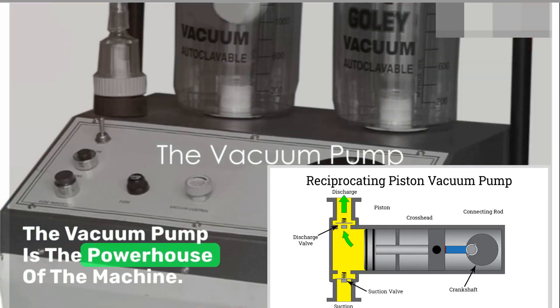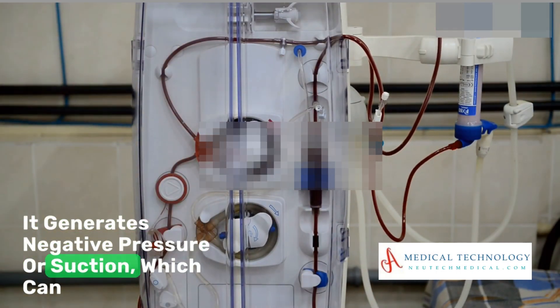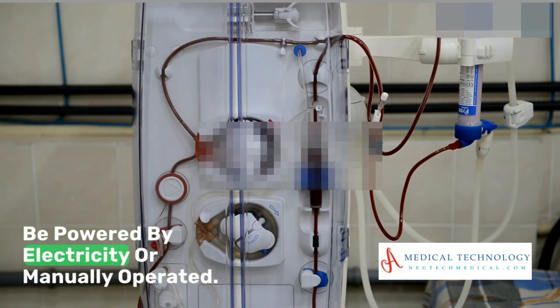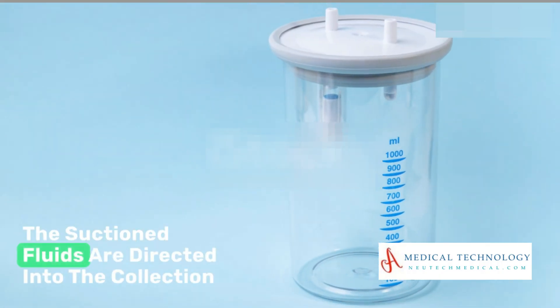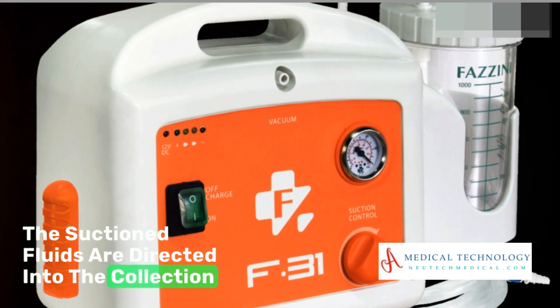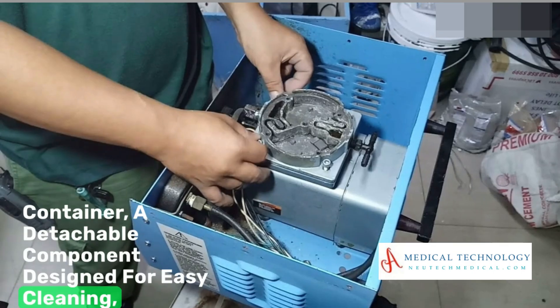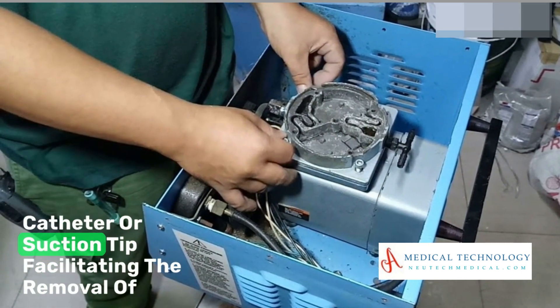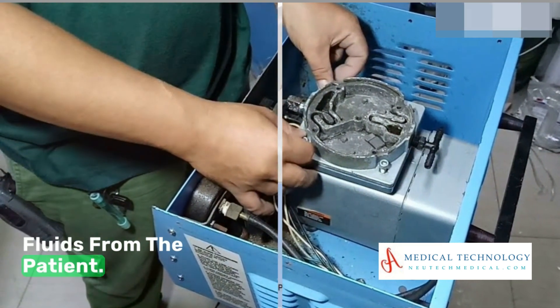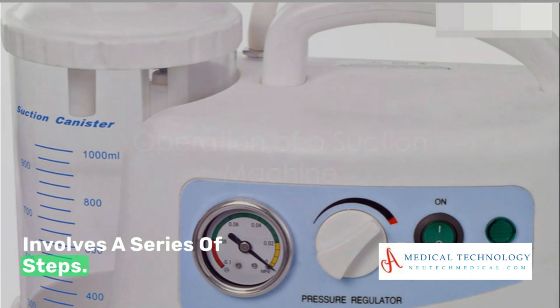The vacuum pump is the powerhouse of the machine. It generates negative pressure or suction, which can be powered by electricity or manually operated. The suctioned fluids are directed into the collection container, a detachable component designed for easy cleaning. The tubing connects the vacuum pump to the catheter or suction tip, facilitating the removal of fluids from the patient.